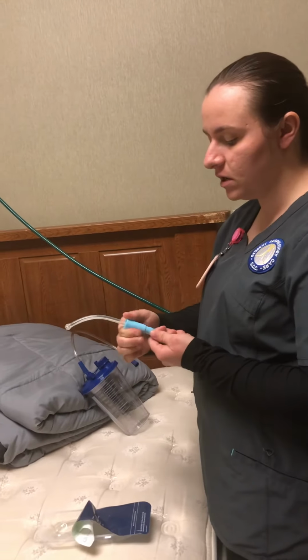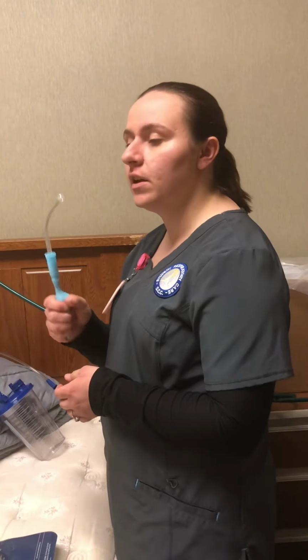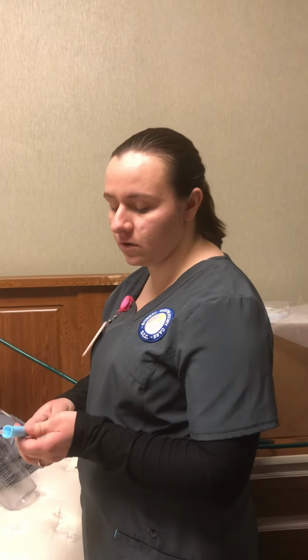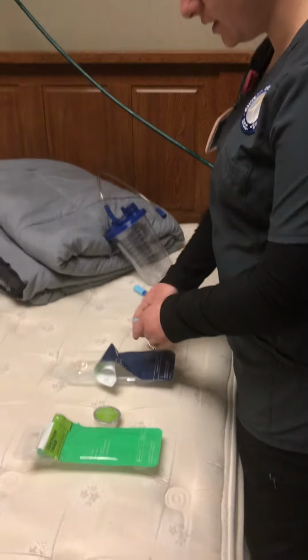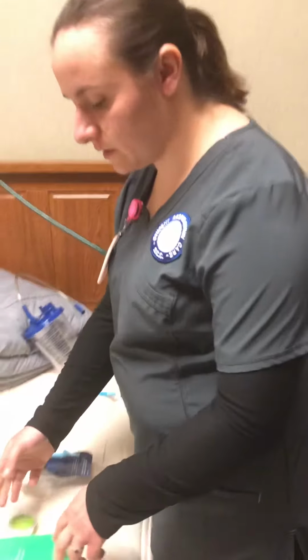So what you do is you remove that protective sheath back and get the side of the mouth, back of the throat, but be careful when doing that so you don't initiate the gag reflex. Set that into the appropriate safe area, and then you can go ahead and begin with your oral cares.